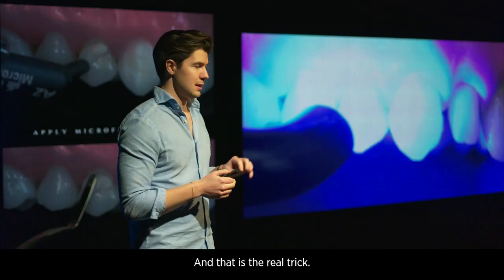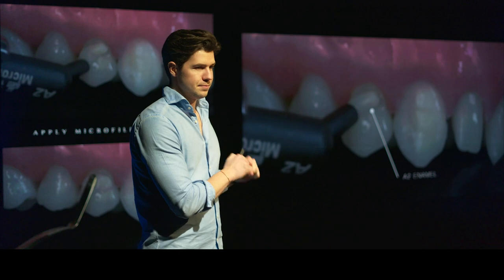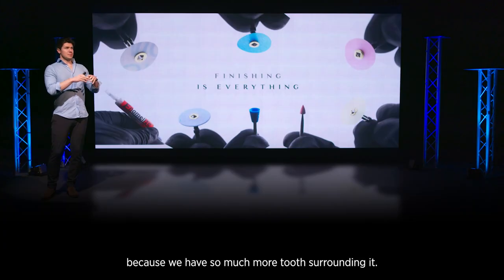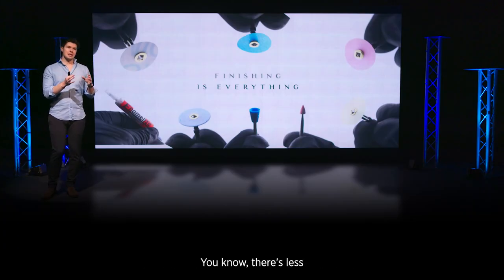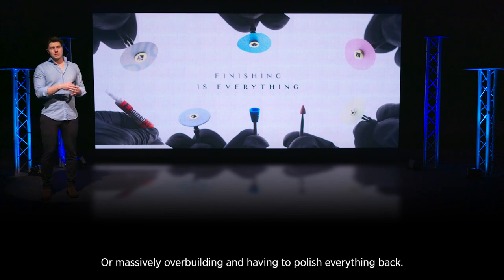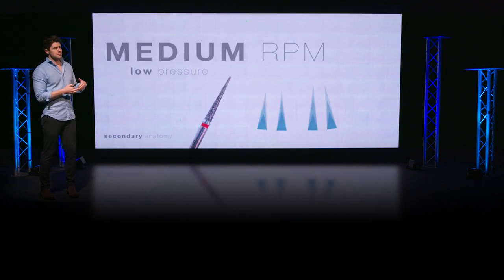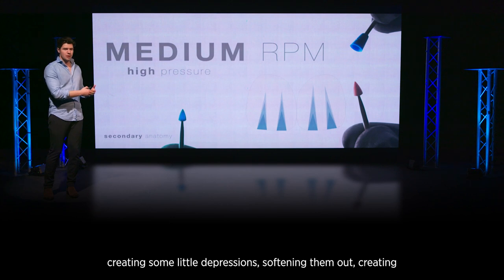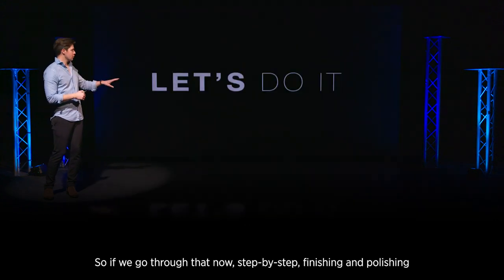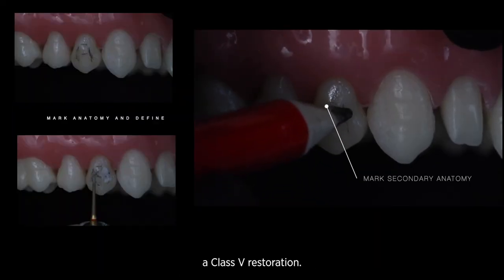That is the real trick — a little bit of modeling resin and the number three brush creates an absolutely beautiful final result. Then we come into our usual finishing and polishing, which is absolutely everything for the longevity of this restoration. With so much more tooth surrounding it, there's less that can go wrong, other than massively under- or over-building. But I'm still going to follow all the similar principles: getting the right basic shape, creating little depressions, softening them out, creating a real high shine, and then an ultimate high shine.